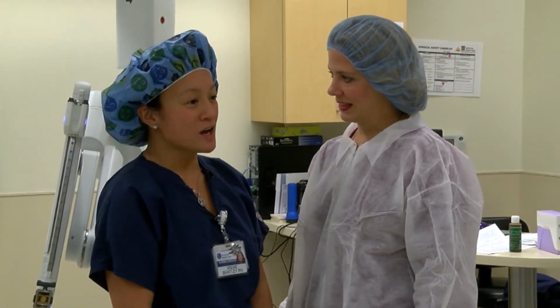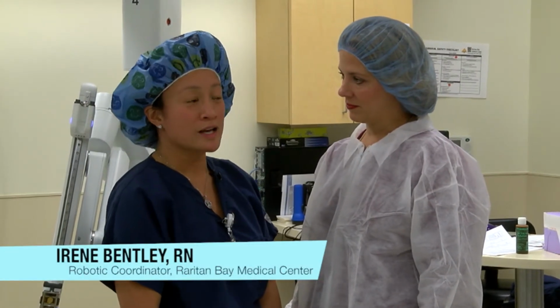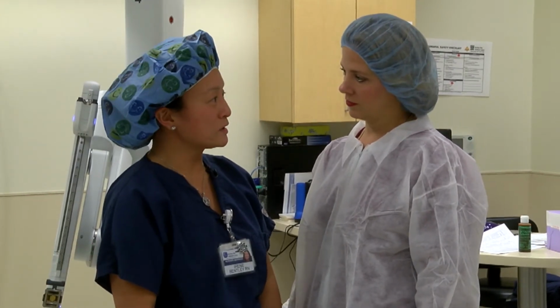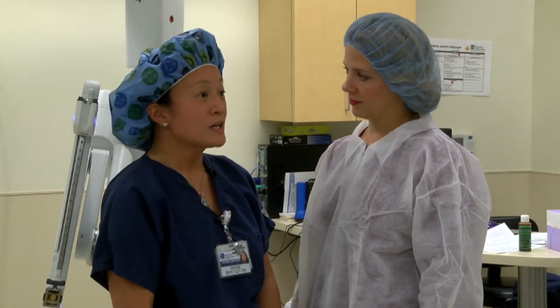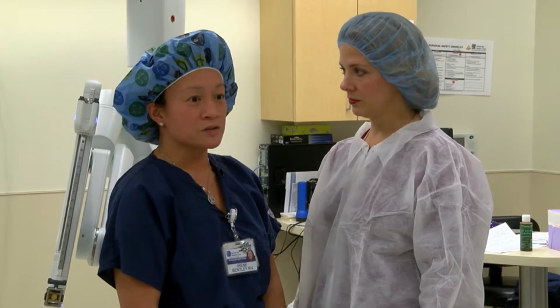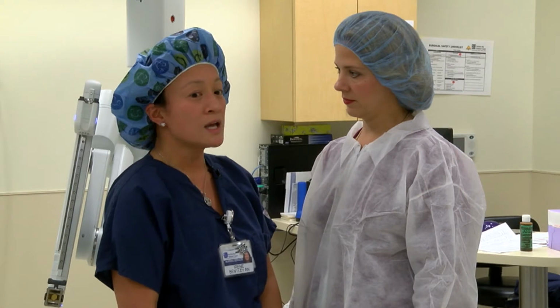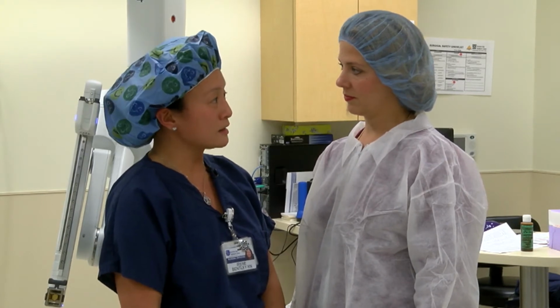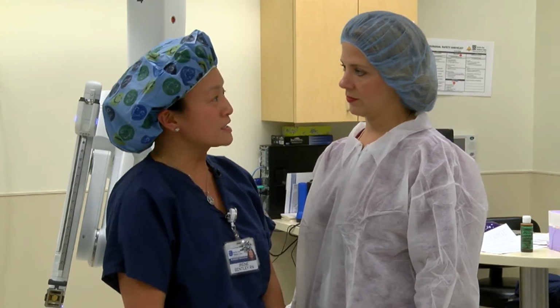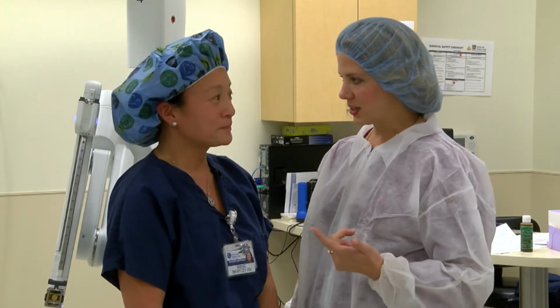I think that for the area here, we've been able to serve them better having the robot. The pain tolerance for our patients, they now have the ability, after having robotic surgery, to go home with minimal medication. So oftentimes the doctors will give them maybe a Tylenol, an intravenous Tylenol here prior to surgery, and an injection of a medication that may last upwards of 24 hours or more. And this way they don't need to take any pain medication. Oh, that's wonderful. So it's actually healthier for them, less recuperation.